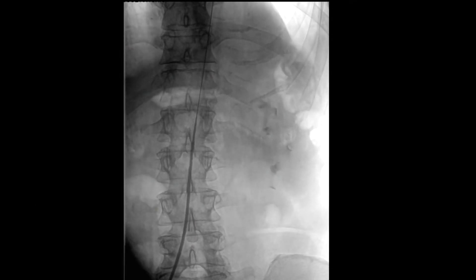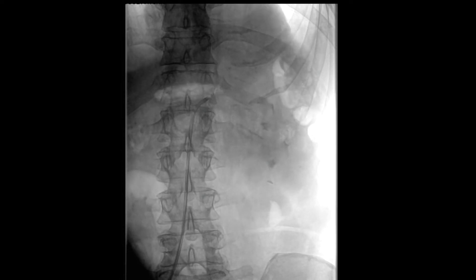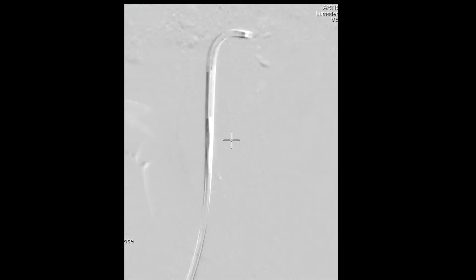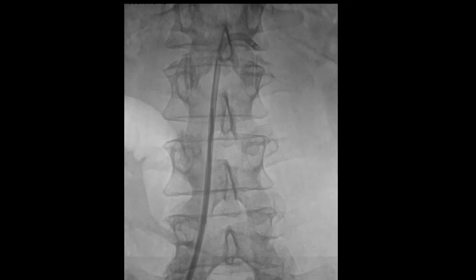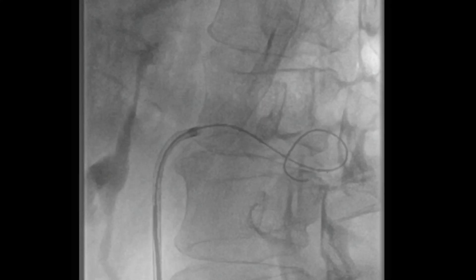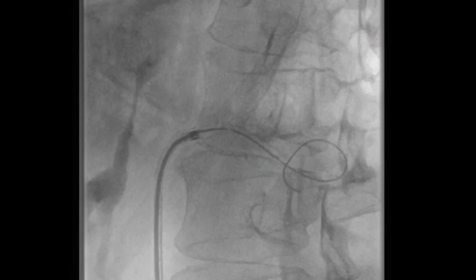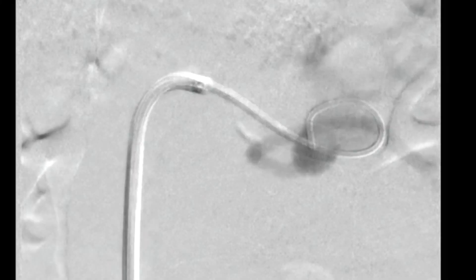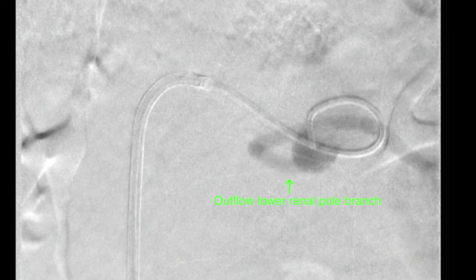Next, a steerable sheath is introduced in the aorta over a stiff angled glide wire, followed by cannulation of the renal artery and performing an angiogram via this sheath. A wire is then advanced into the aneurysm sac, followed by advancement of a glide catheter and performing a renal artery angiogram.